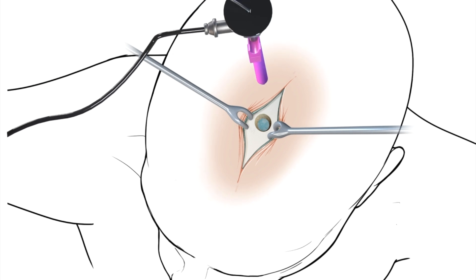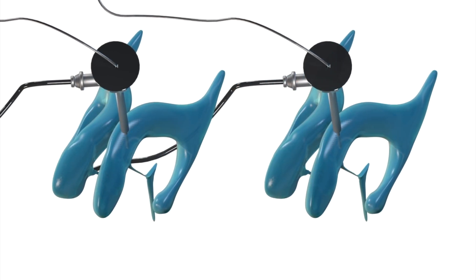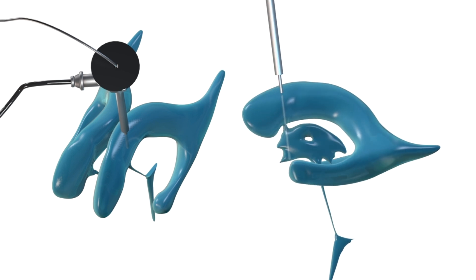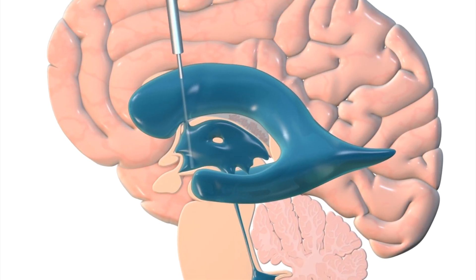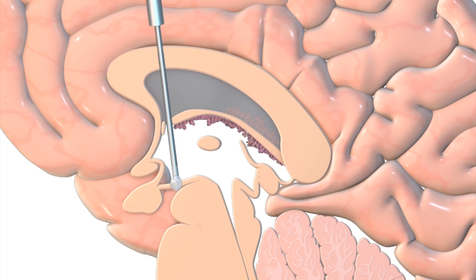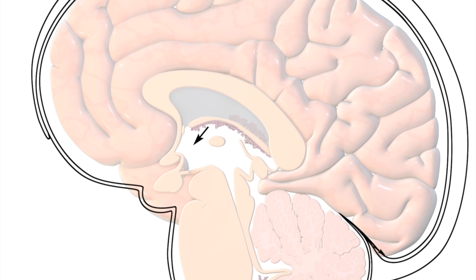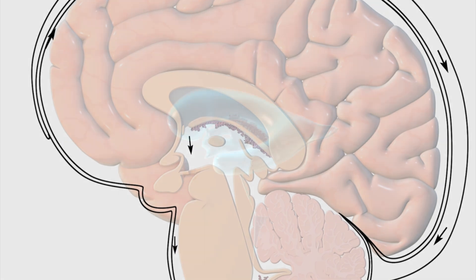Once the burr hole is created, we introduce an endoscope — a small camera — through a peel-away sheath using neuro-navigation. Through that burr hole, we are able to insert the camera into the brain and down into the lateral and ultimately the third ventricle. We pass instruments through the rigid endoscope where we create an opening or an ostomy at the base of the third ventricle. This allows a new outflow tract for cerebrospinal fluid to exit the ventricular system, relieving increased intracranial pressure and offering a final solution for obstructive hydrocephalus.